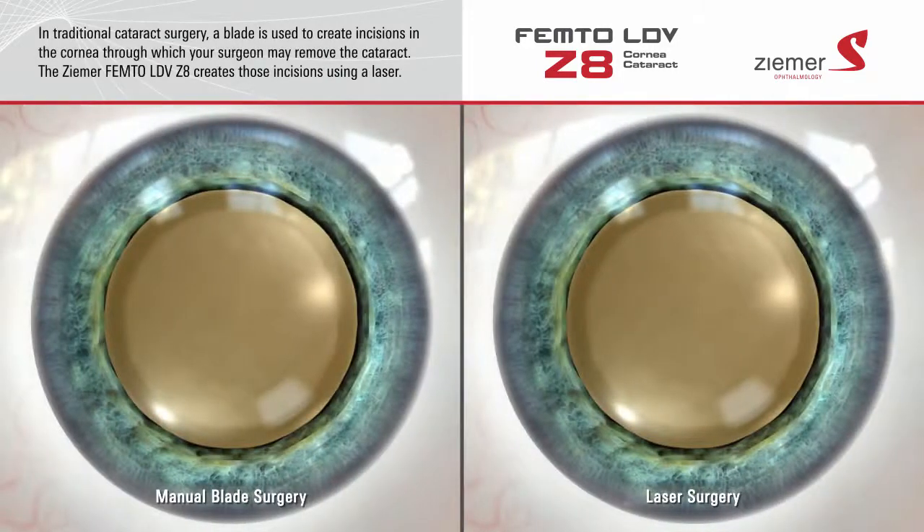In traditional cataract surgery, incisions into the eye are manually created with a blade. These incisions allow your surgeon to insert the instruments used to remove the vision-blocking cataract. The Zeemer Z8 laser creates these incisions using a beam of laser light, providing very precise and customized incisions with Swiss-engineered accuracy.